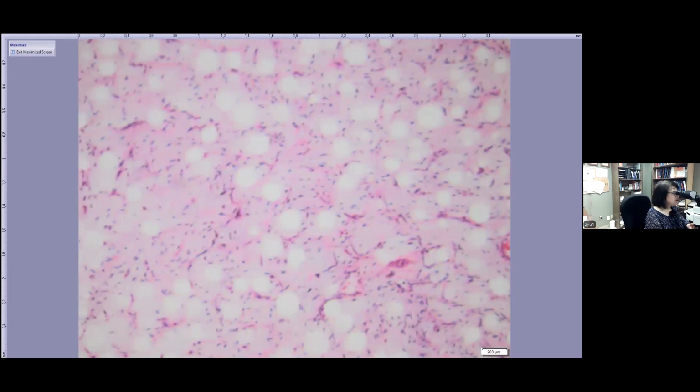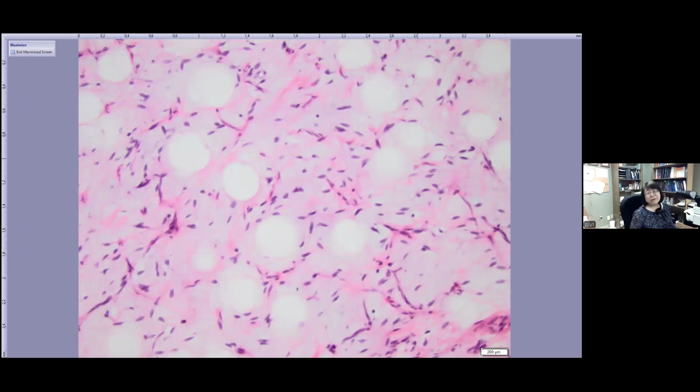This one I do not have a pulmonary edema-like area. What I have is more like a myxoid and chicken wire vessel. If this were in an older child, like a 15-year-old, 17-year-old, I would consider this could be a well-differentiated myxoid liposarcoma. But this is very young, and the likelihood is lipoblastoma. Lipoblastoma and myxoid liposarcoma have some morphology overlap. Lipoblastoma can have a mucin pool, like a pulmonary edema-like area. Lipoblastoma can also occasionally have a rare mitosis. And they all have a myxoid change and chicken wire vessels.